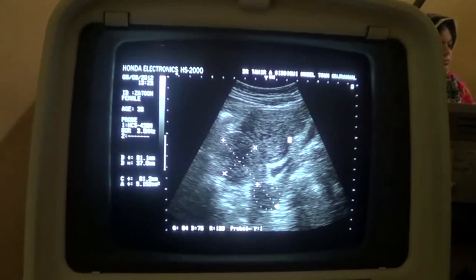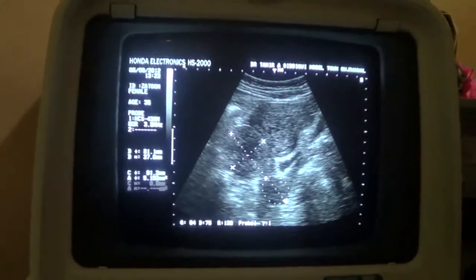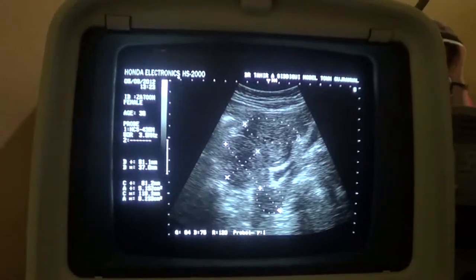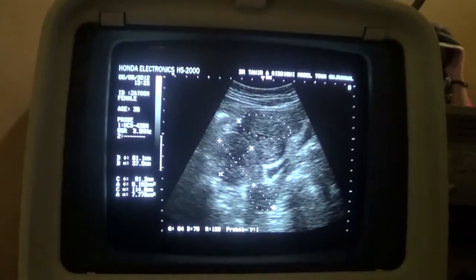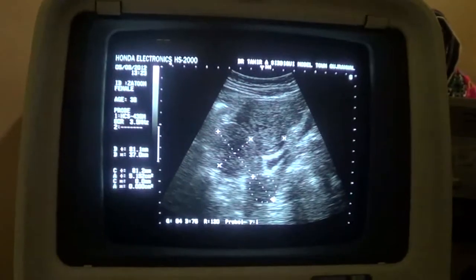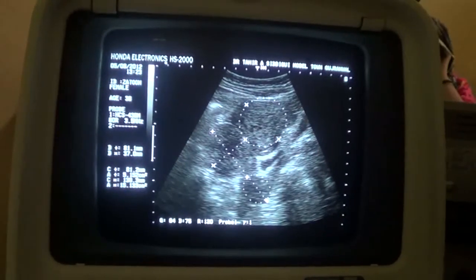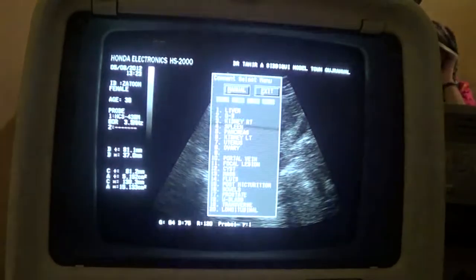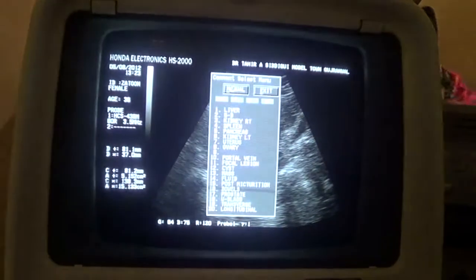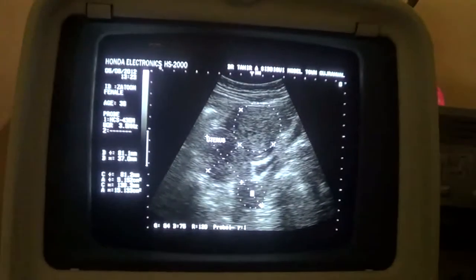Here, this is the solid echogenic area. This is an approximation now. So this being the uterus, and there is history of induced abortion.